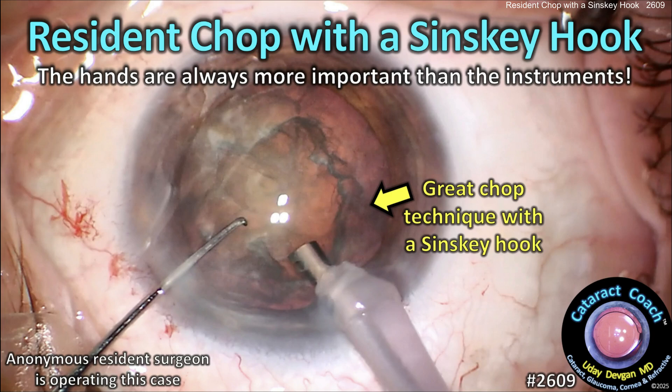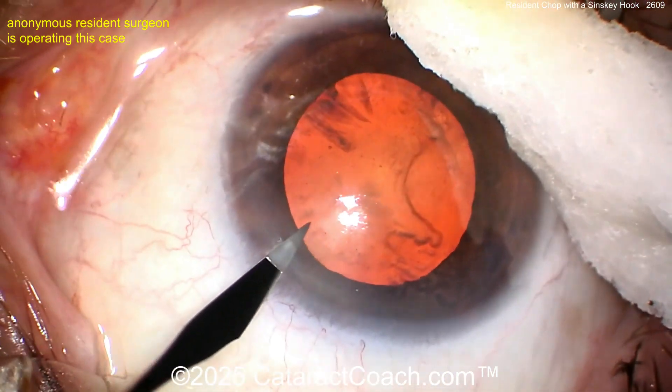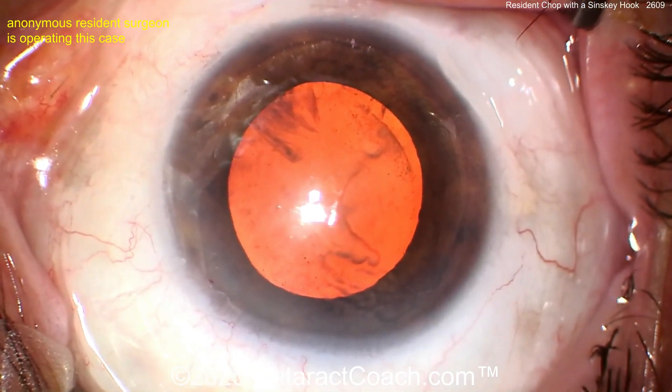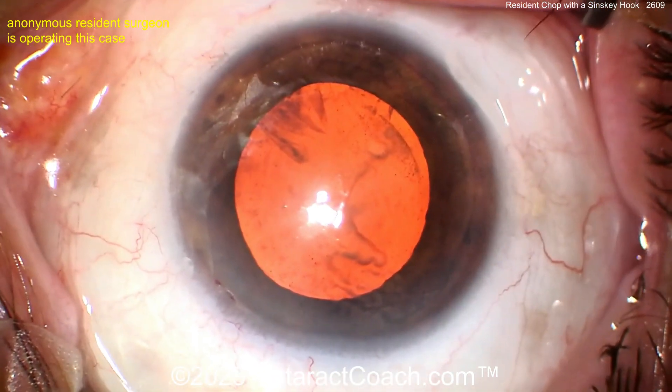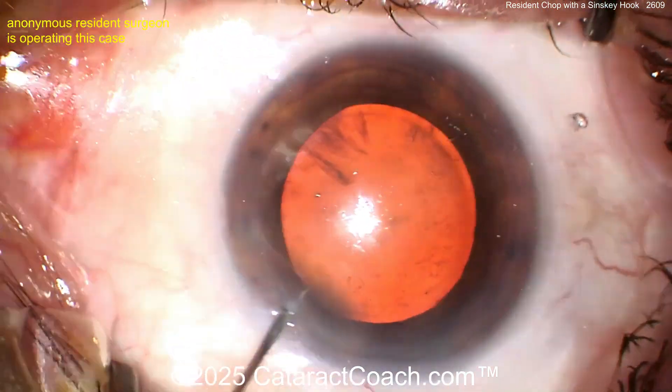Cataractcoach.com — a resident chop case with a Sinski hook. Remember, the hands are always more important than the instruments. We've got an anonymous resident here operating; we don't know exactly how many cataracts have been done by this young doctor. We start off with a paracentesis — reasonably good draping of the eye.